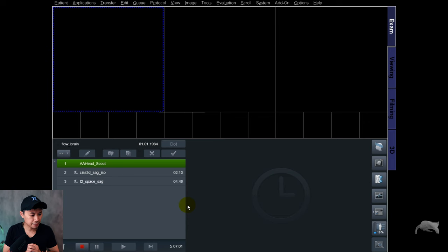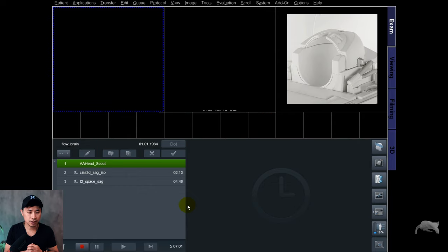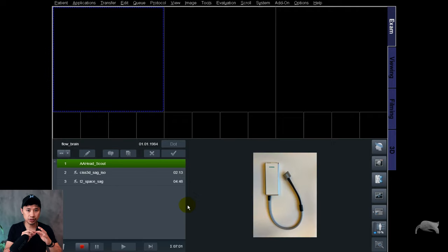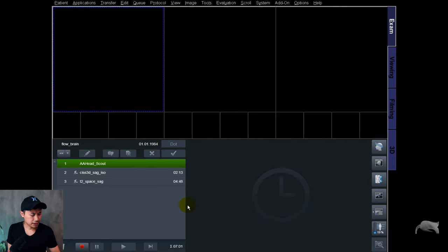All right, we are live at 3T, and for this purpose also using the head 32 channel coil. Nevertheless, it's also possible to do this on 1.5 Tesla. One important message I want to share with you is that we are also using the PMU on the finger for this purpose, when it comes to phase contrast gating. All right, so let's go.